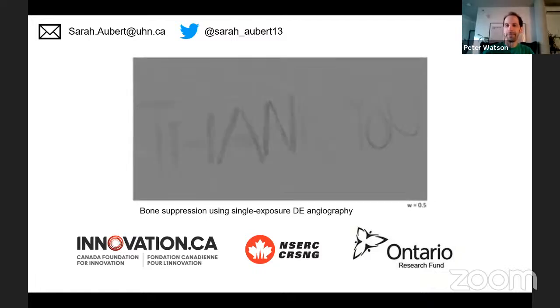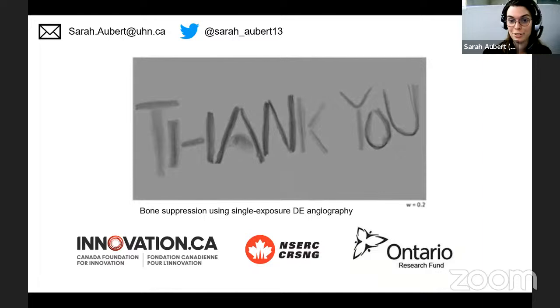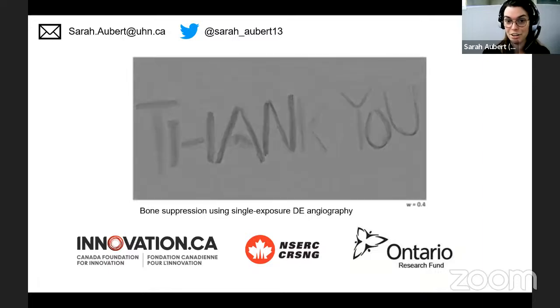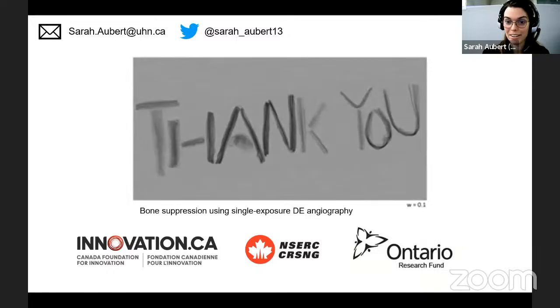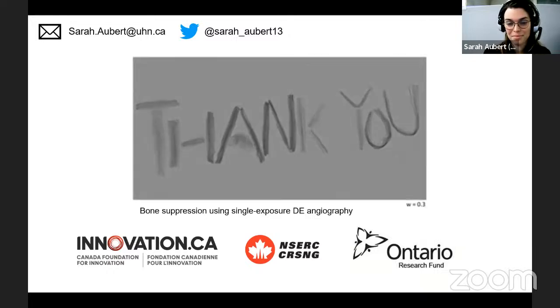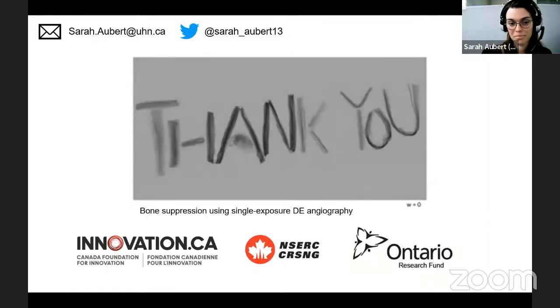They do this for aneurysm studies. They study really high speed frame acquisitions using a photon counting detector. Their application of the photon counting detector is actually not like ours in suppressing material, but they're taking advantage of that quick acquisition time and temporal resolution. So it's not a problem. It's actually setting the bar in terms of how fast you can acquire data. Yes. Okay, very nice.